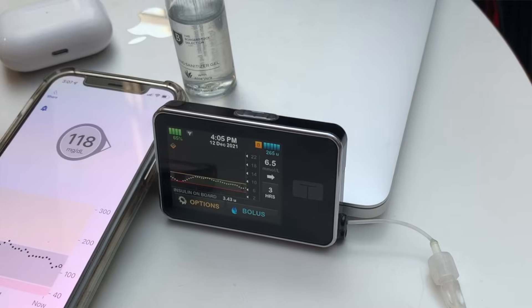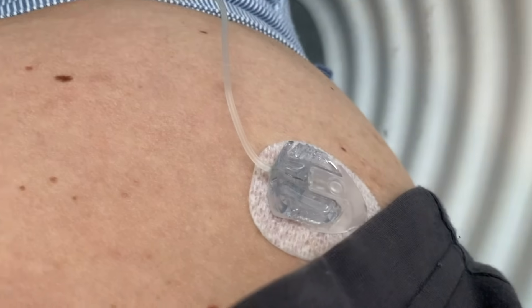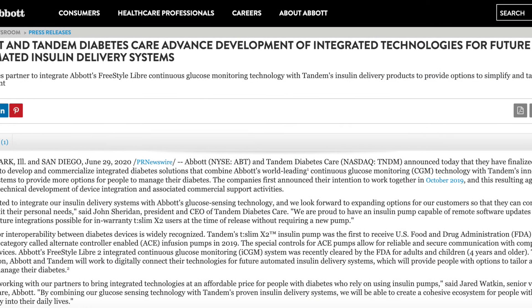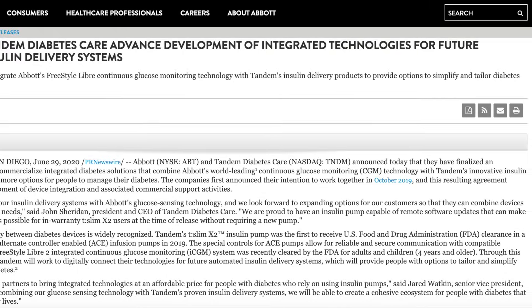What's probably the most amazing thing about T-Slim X2 is that it integrates with a continuous glucose monitor — specifically with Dexcom G6 — enabling automated insulin delivery based on CGM glucose data. T-Slim will probably also integrate with Dexcom G7 at some point, and Tandem and Abbott have already announced a partnership since June 2020 to develop a similar integration with Freestyle Libre.